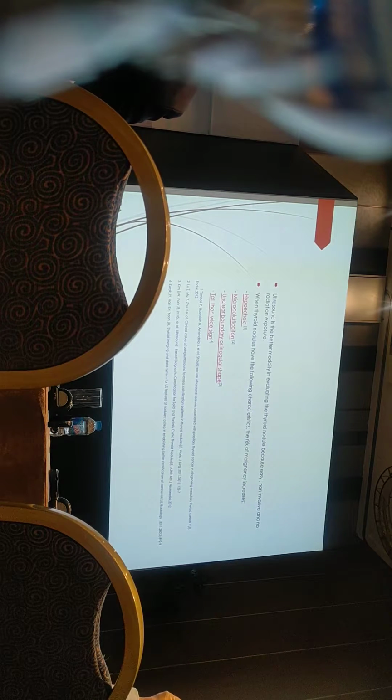And the third one is the margin of the lesion. We know that usually a benign lesion has a regular margin. If the margin of the nodule is irregular or unclear, we will also consider a malignant possibility.